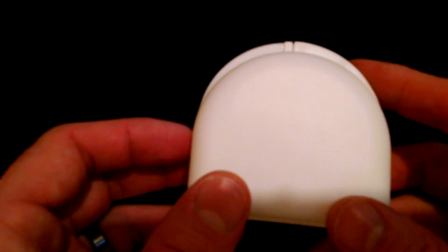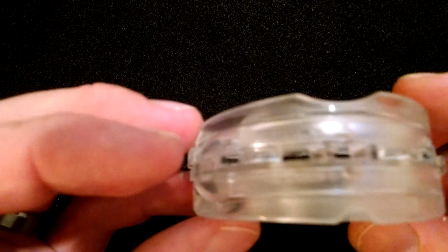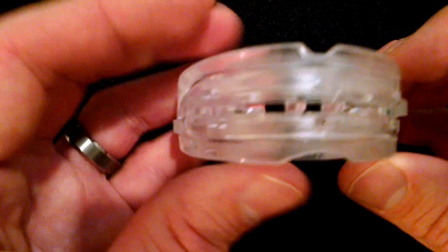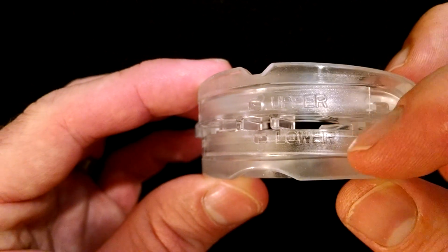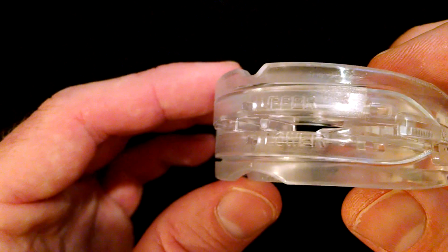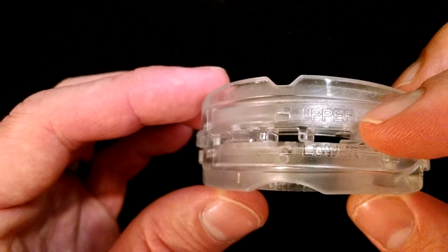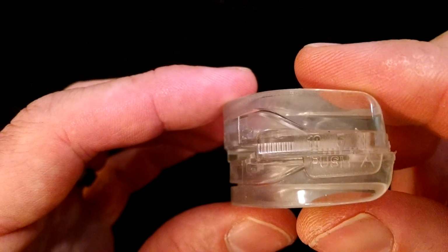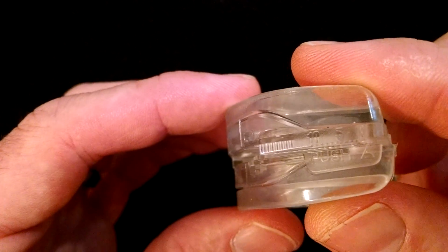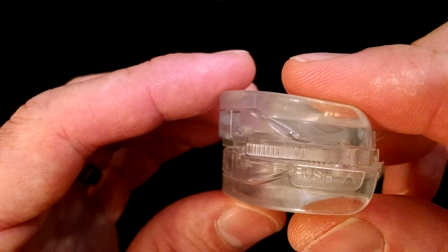Then the actual mouthpiece, which is contained within this hard plastic case. This is the Eliminator Pro. You can see here there is an upper and then also a lower tray. So whenever you're creating an impression, you want to make sure that you put this in properly with the upper facing up, of course. Then over here on the side you can see there's a ratcheting system with the numbers 1, 5, and 10, and this is for the advancement setting.